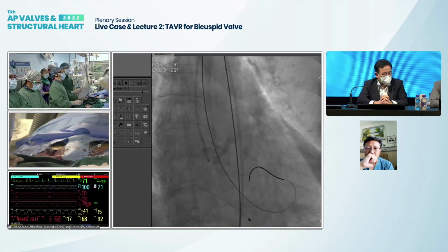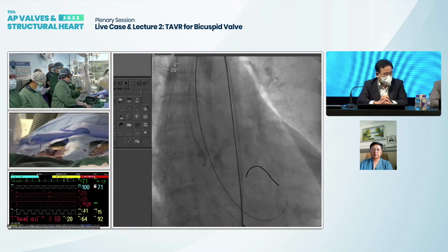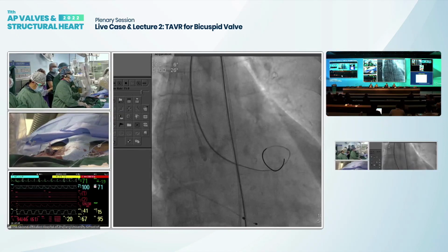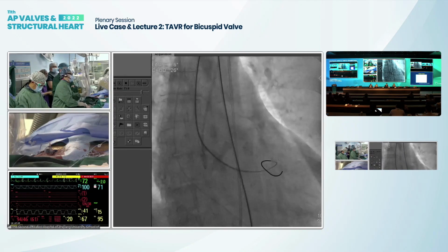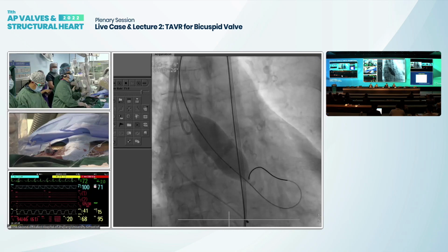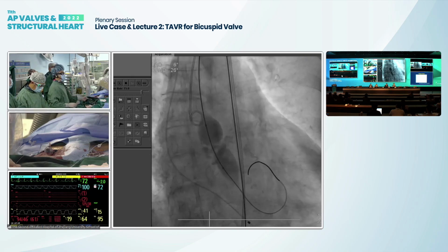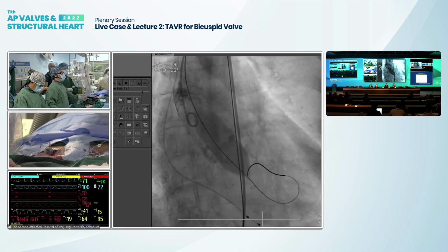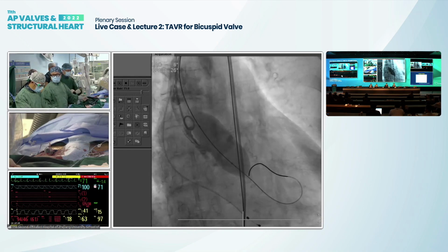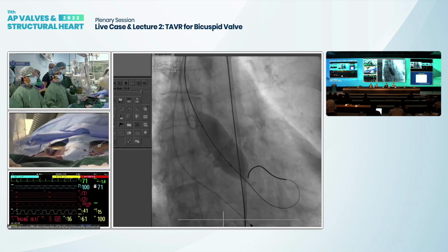Okay. Since we applied the Hangzhou solution, the average pacemaker implantation rate is around 8%. Okay. So Dr. Wang, you're preparing a 26? Yes, go ahead. Prepare. Okay, 26. Get ready? Yes. The second question is about the coronary.